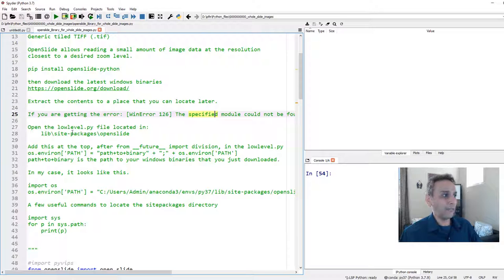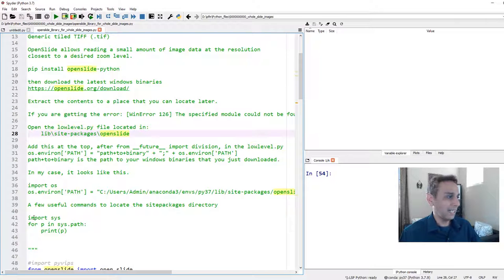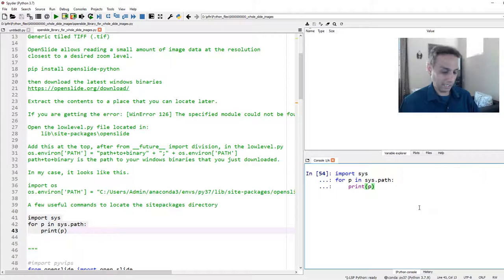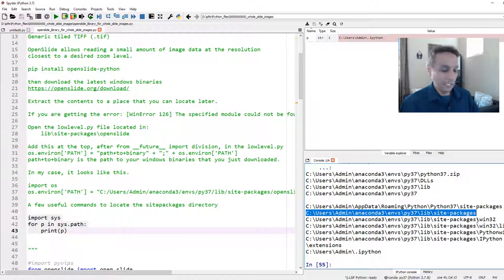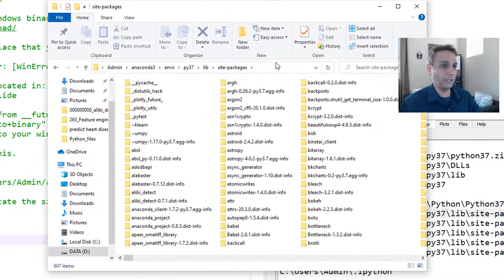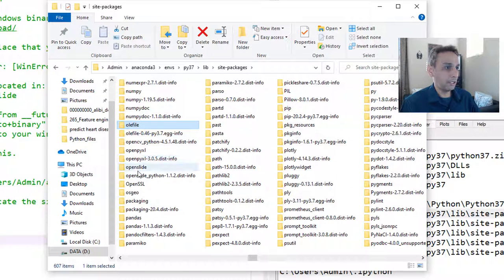To fix this, open the file called lowlevel.py, located in site-packages/openslide. I have a few lines of code to locate that path. Running them tells me exactly where my Python 3.7 environment is installed, so I can find the site-packages folder and then navigate into the openslide directory to find lowlevel.py.